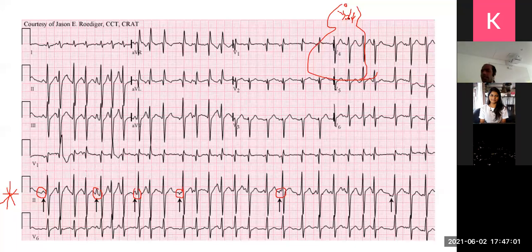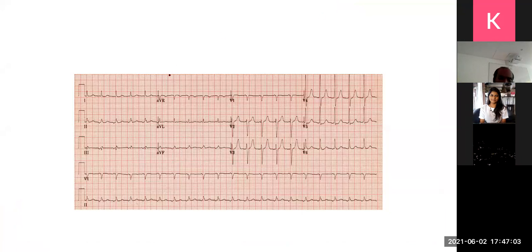I will come back to this. Just look at this for a second. Look at lead 2. QRS is normal, but look at the P wave. The P wave is abnormal. The first thing you have to say is that the P wave is abnormal. So it is an atrial rhythm. Can you see the P wave? I have circled the P wave. It is abnormal. So this is an atrial rhythm.